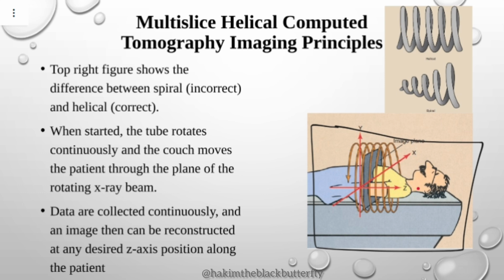The helical and the spiral, they are used interchangeably. There are some people that call it helical scanning or spiral scanning. These two words can be used interchangeably, but in the right English, they are different. As you can see in that top illustration, these two are different.